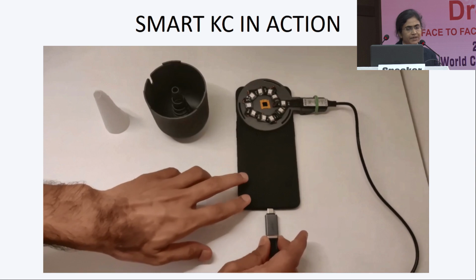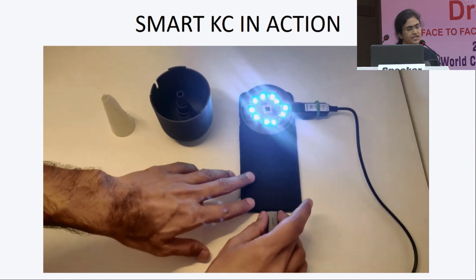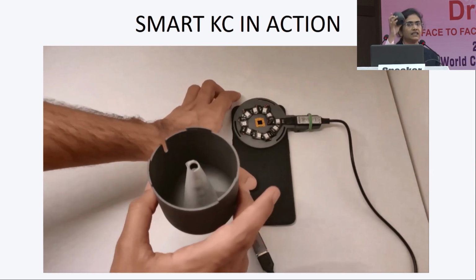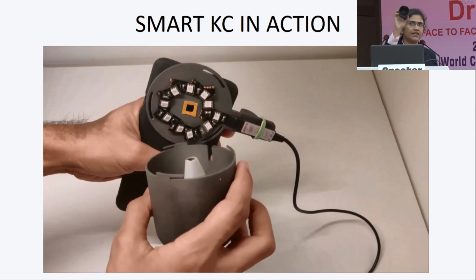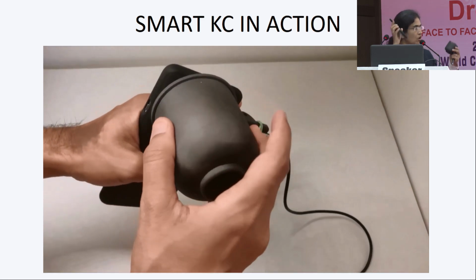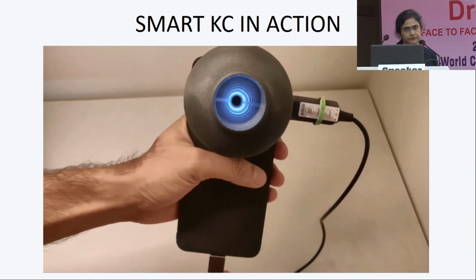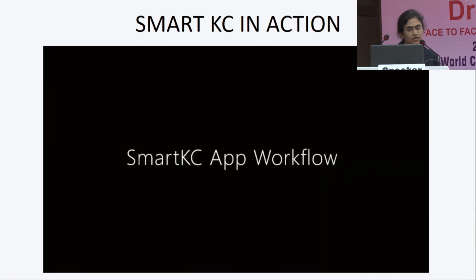So this is the assembly. This is actually the machine. What is important here is ours is a very cost-effective machine. This is a small paper, a butter paper of 2 rupees. This is a 3D model of nylon material which is just prepared with a ring inside, and we have these LEDs which are put. The total cost of this comes up to just 2,500 rupees. And after assembly, it is attached over the eye, and these are the rims, as you can see, the internal ones, which give very clear mires over the cornea.